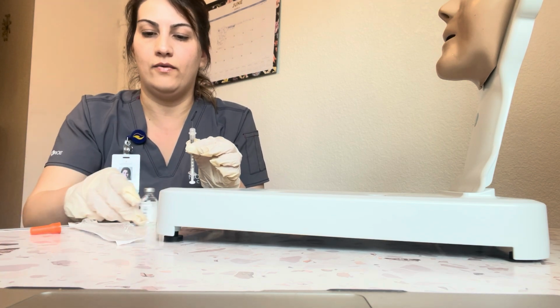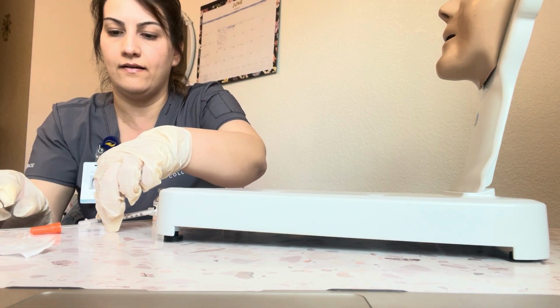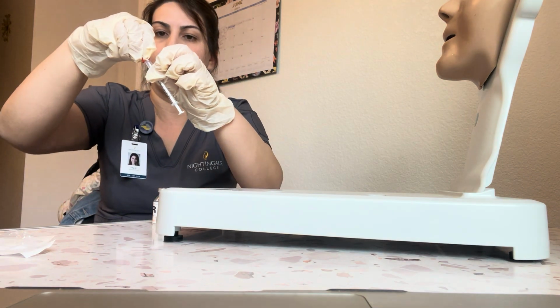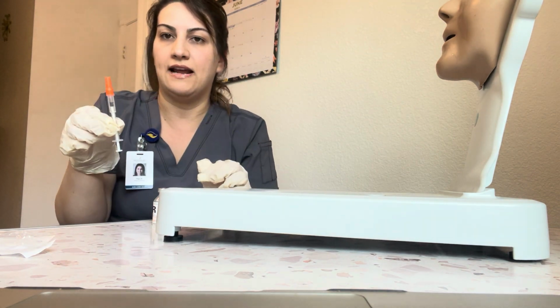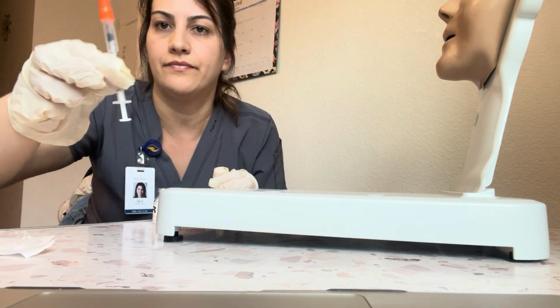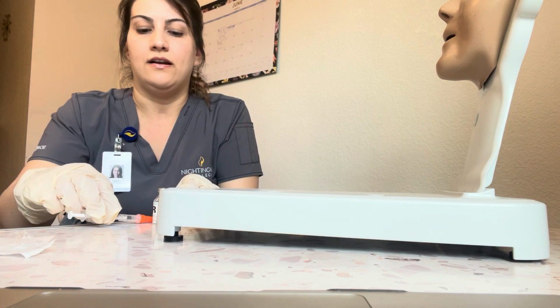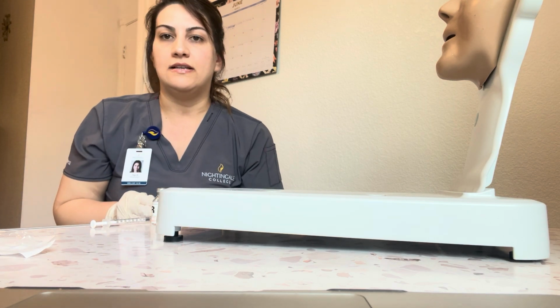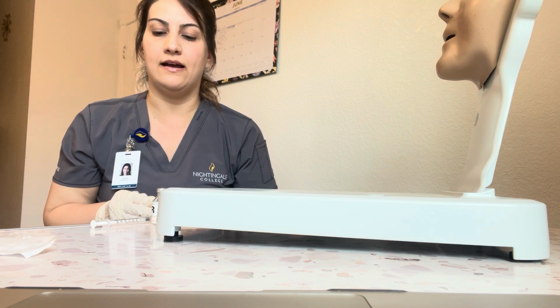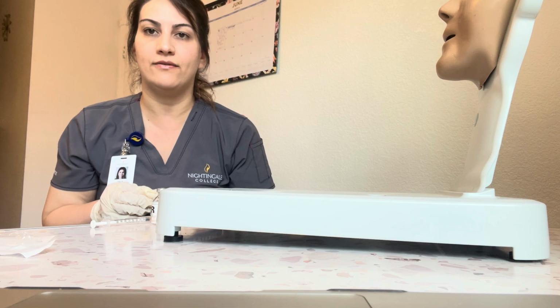Next, I want to use the scoop method here. Nurse and I verify against MR 8 units of insulin. As this is ready, my medication is ready to go. If I was going to do this away from the bedside, I would label the medication vial with the patient's name and dosage amount. Thank you.